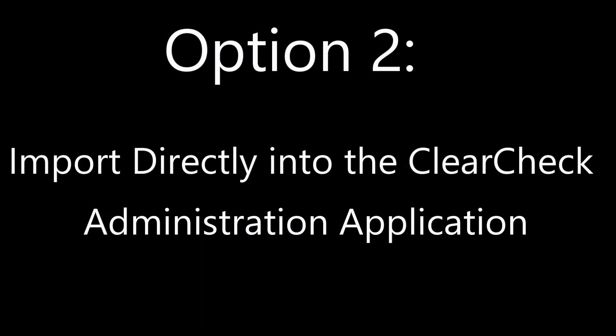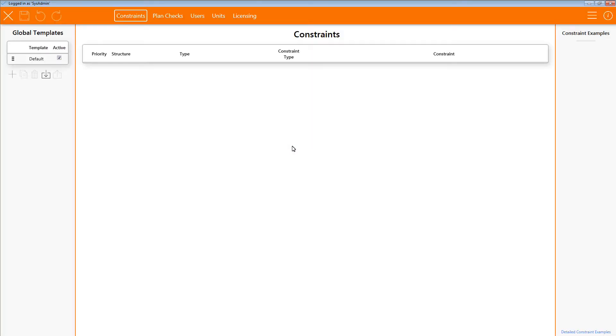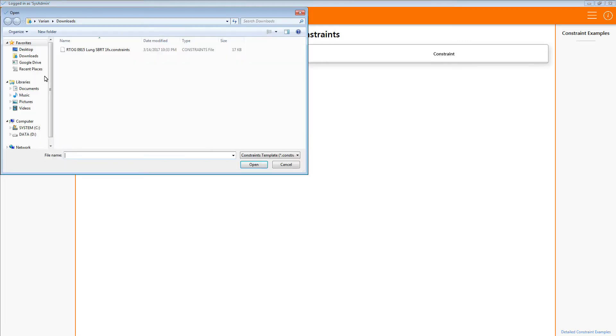The second option is to import a constraint template using the ClearCheck administration application. Importing this way will make sure everyone has access to the template in the Patient Template Manager. You will need the proper user rights in order to launch the ClearCheck administration application. Log into the administration application. Make sure you are on the Constraints tab. From here, click the Import icon located here.